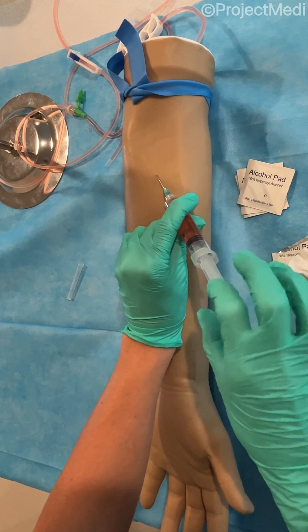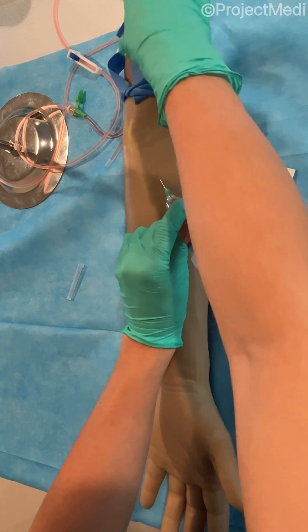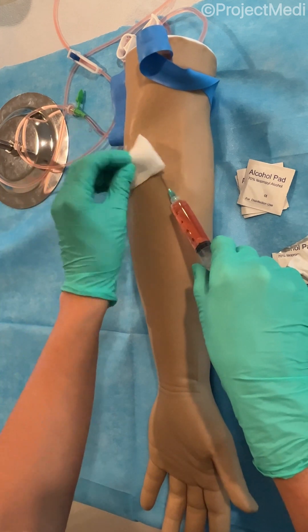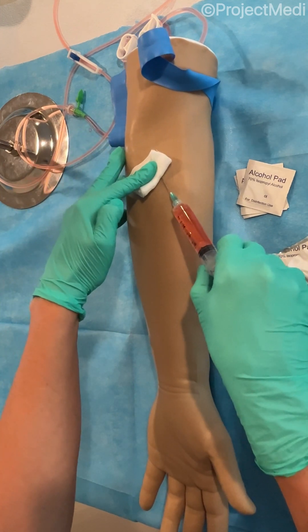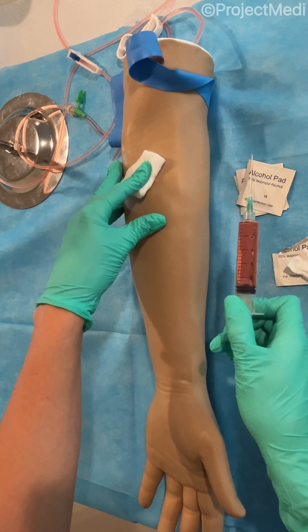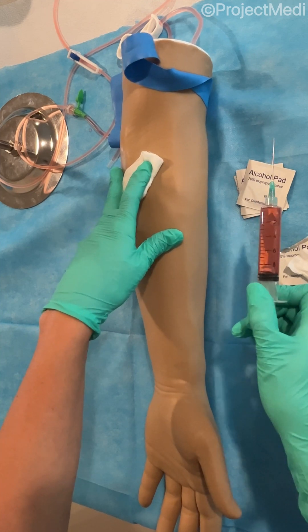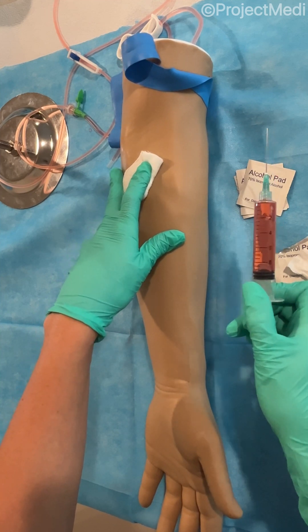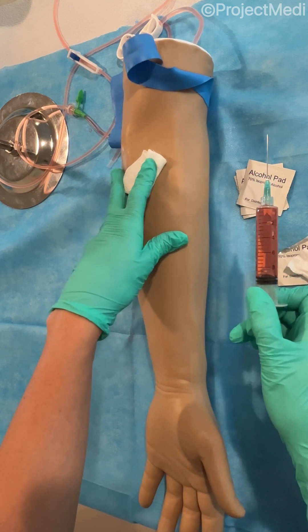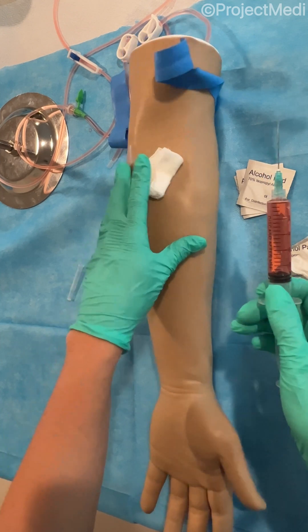Once you have your specimens collected — and some may require various blood tubes — you can go ahead and release your tourniquet, take your gauze, apply it to the venipuncture site, and carefully remove the needle. Cap or safely close your needle to prevent any needle sticks and safely dispose of the needle. Then you will want to label the specimen with the patient's name, date of birth, and time, and follow your organization's policies on where you'd be sending this or what would need to be done.